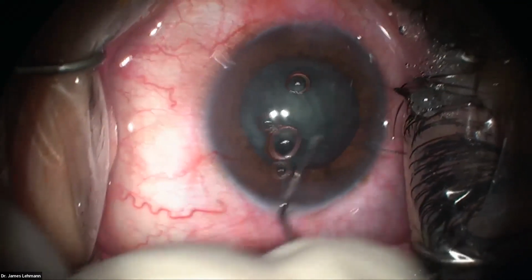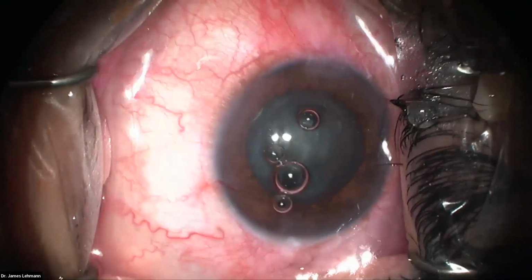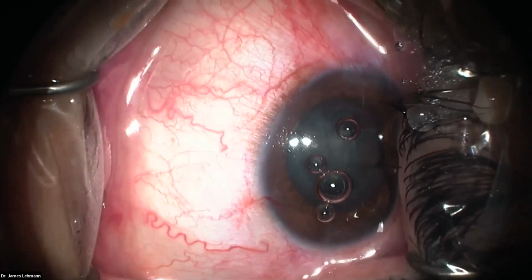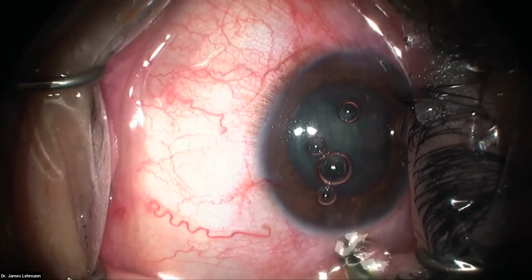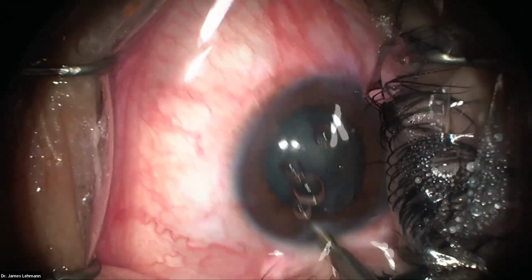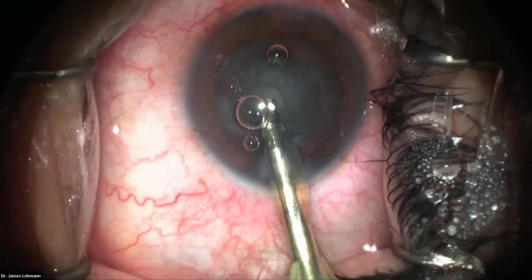But you can see there I'm able to rotate it slightly. I'll show you. You can always go back and hydrodissect more if you have to. And that's kind of a good tip to do. So here's another tip. You want the phaco tip exposed about that much. And then I'm going to go above the eye and just kind of rinse the eye a little bit. And then that allows you to get some of that oily surface film off. And then I'll get you nice and centered here.